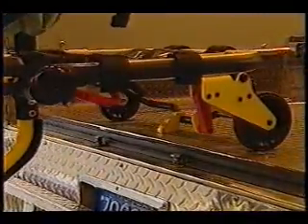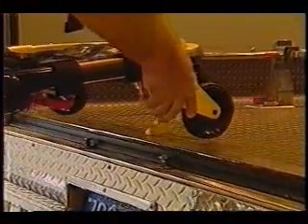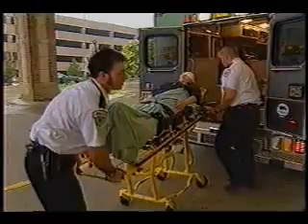If you have the optional safety hook, it'll engage the safety bar to prevent that cot from moving out of the ambulance before you're ready. Disengage the safety bar and roll the loading wheels off the ambulance floor.